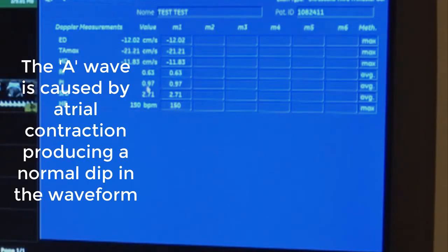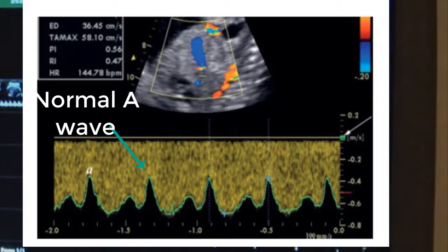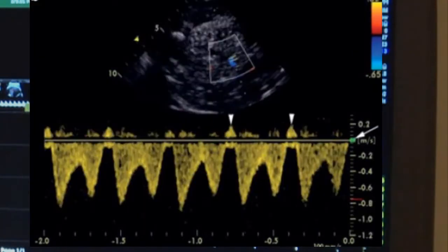It usually shows pretty much end changes, and so by that time you can see the baby's not well. And a lot of changes happen before the ductus does.